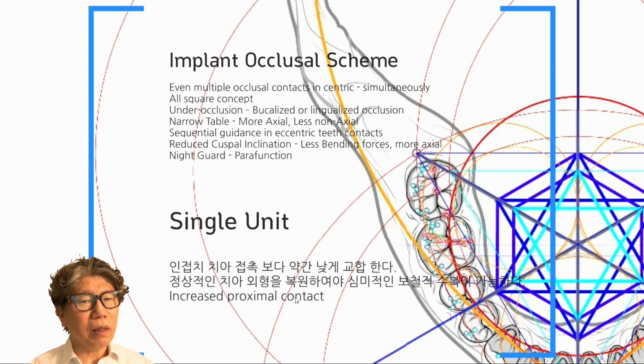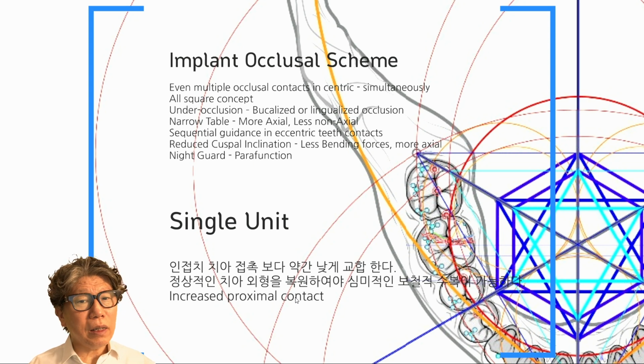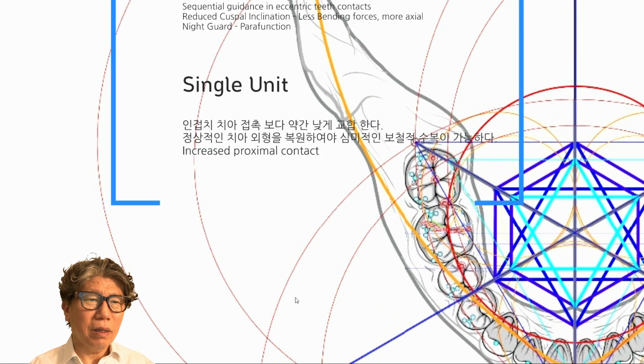Looking back after experiencing such events, I realized that we used a lot of screw-retained implants back then. It seems we preferred surface contact whenever possible. Of course, textbooks recommend point contact, but in fact, as one ages, point contact almost disappears, and surface contact becomes more prevalent. Therefore, if surface contact is restored well, food packing decreases, and screw loosening is also prevented. However, there are quite many cases where screw-retained ones are unavoidable.